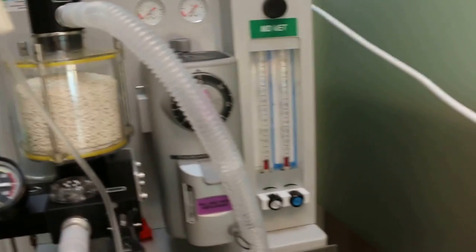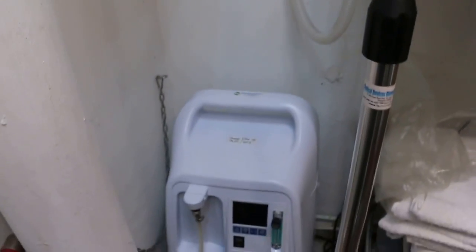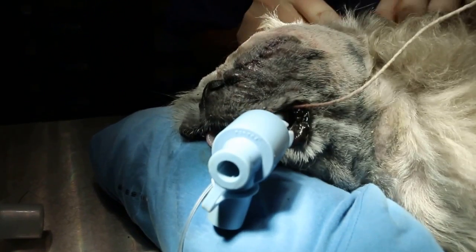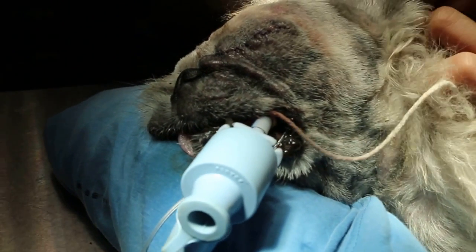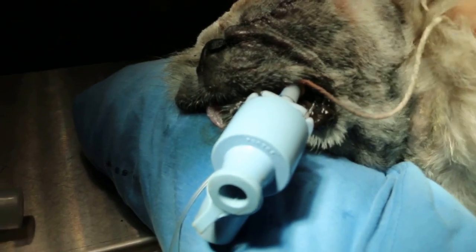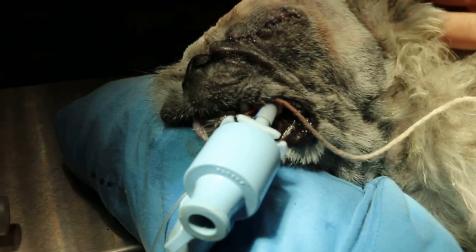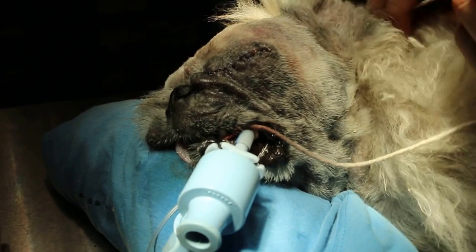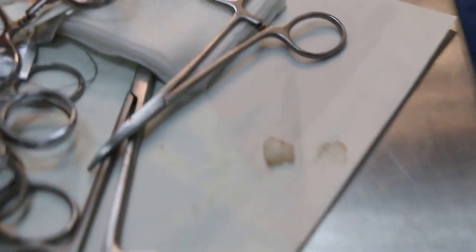Then the anesthetic is switched off already. Oxygen on. Is color okay? Yeah, color is okay. Just gas anesthetic. The dog had a drip yesterday. You can see the other video. Just found the lenses here — this is a 13-year-old — and the lenses are cut out.